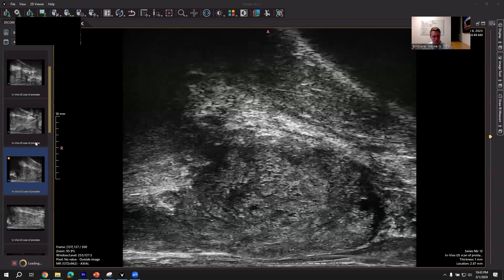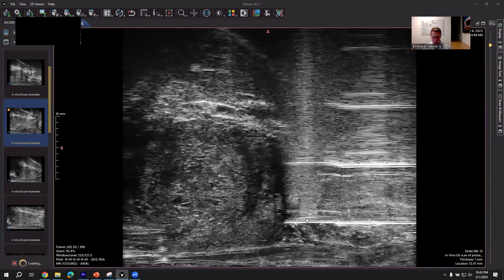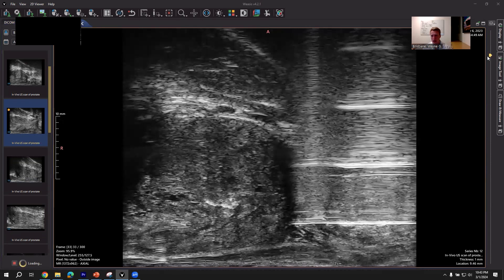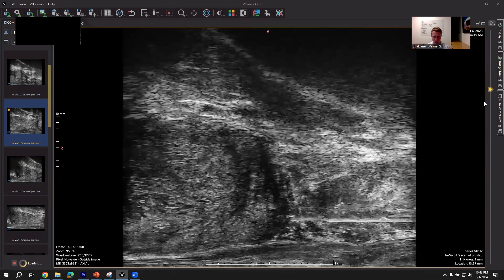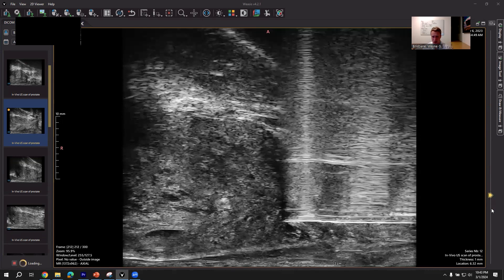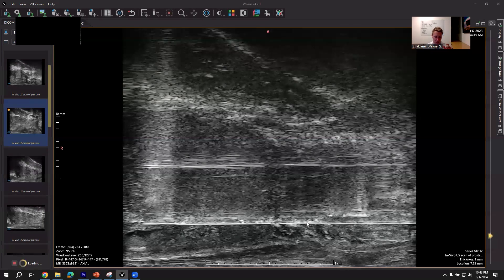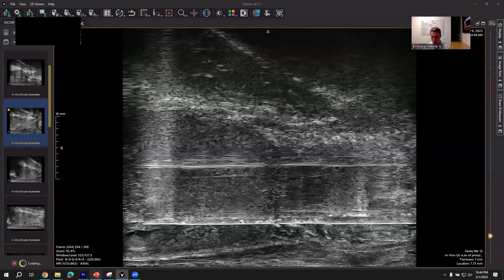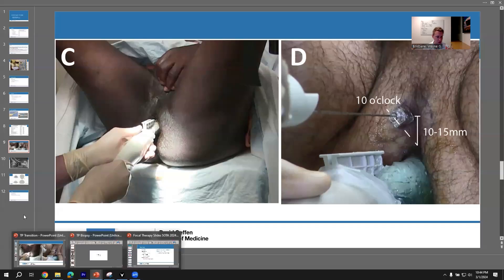After that, you're going to do the biopsies. You have your plan and it's just about executing it. Here's an example of a posterior — this looks to be mid posterior. There's the urethra — I'm not too far off. I'm going back to check where I am lateral to the urethra, and then just watching this under ultrasound guidance. If you have a needle guide, it will always be under guidance — you're kind of pivoting. If you have a double freehand technique, you've got to roll the ultrasound over to find your needle. But it's not very technically difficult once you have developed the muscle memory to do so.